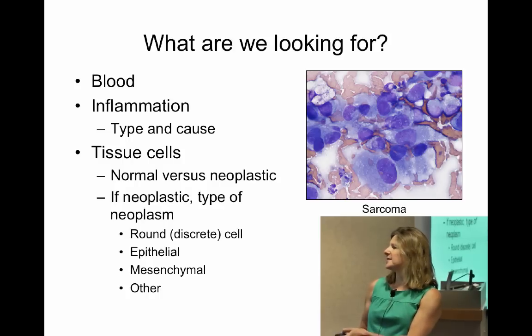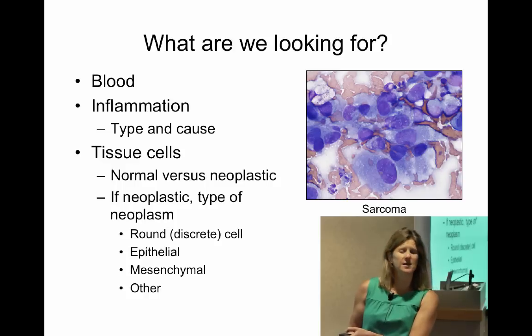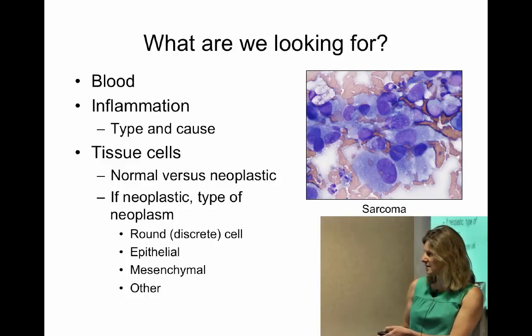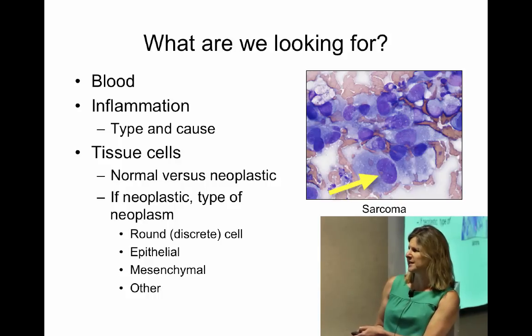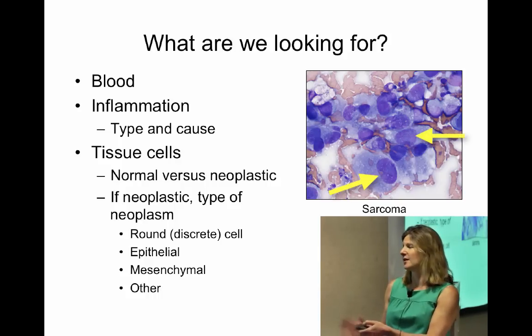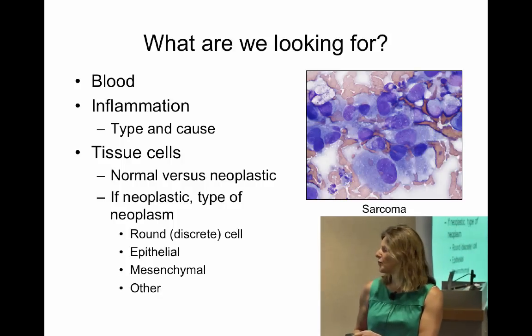And then we have the mesenchymal tumors, and this is a sarcoma. How do I tell this? Because there are red cells all between these cells, so even though they look like they're hanging together, they're not. And if you look at their individual shapes, they're more spindled than they are anything else. And this was a hemangiosarcoma, and it's showing gorgeous cytologic criteria of malignancy, huge nucleus here compared to this, and there was lots of other cytologic criteria of malignancy that I can't show in the slide.